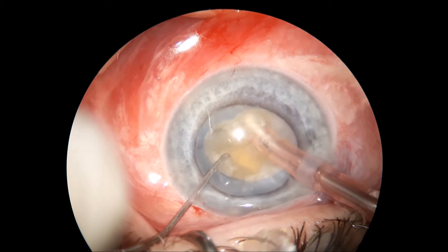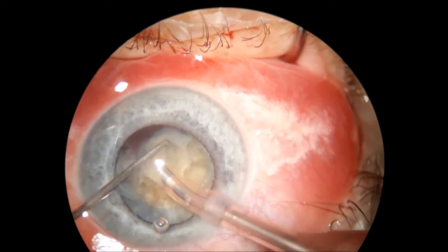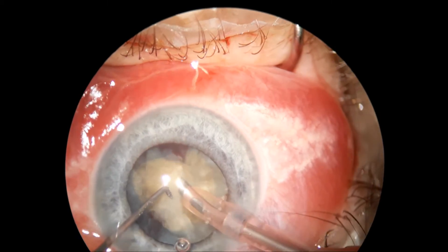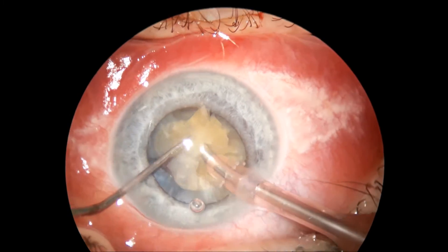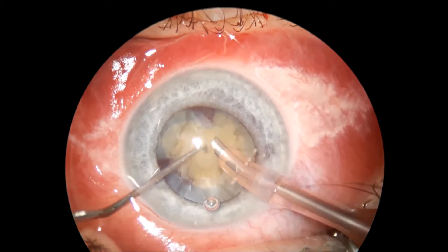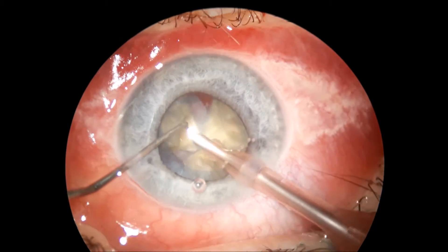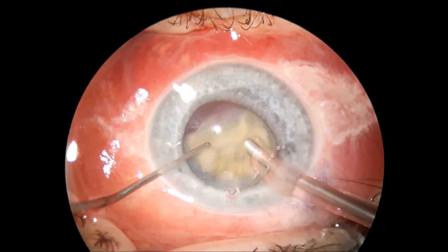Notice the bevel of this phaco tip — I keep the bevel down in order to have a clear cornea the next day in these leathery nucleus and hard intumescent cataract cases. I keep the bevel down and I am trying to do the phacoemulsification inside the bag as much as possible.